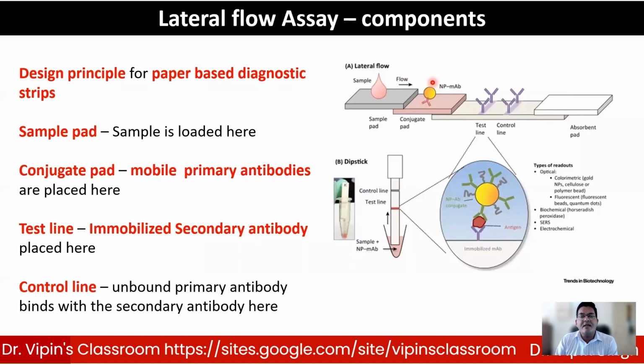So this is not exactly ELISA, but yes, kind of ELISA in the sense there is an antigen-antibody reaction, which is being reported in terms of color because of the accumulation of gold nanoparticles, right? And depending on the size, you'll have different color. You remember gold nanoparticles. So here you'll use a specific size so that you know what color line you're going to develop when there is a positive test.